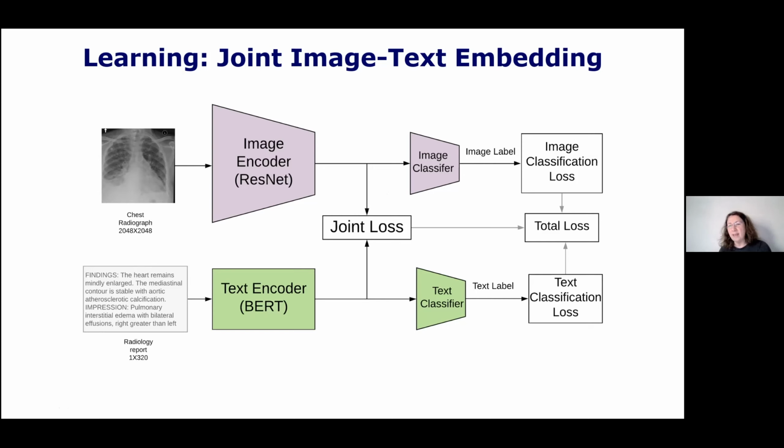But it's more than that. Remember how the number of available training data dropped by an order of magnitude when we went to the heart failure cohort, and then by another order of magnitude when we went to labeled data. And so again, we realized that it would be a pity to have all those images lie around and not contribute, the images we couldn't label. And so what's happening here is that the joint loss can be trained based on unlabeled image-report pairs.